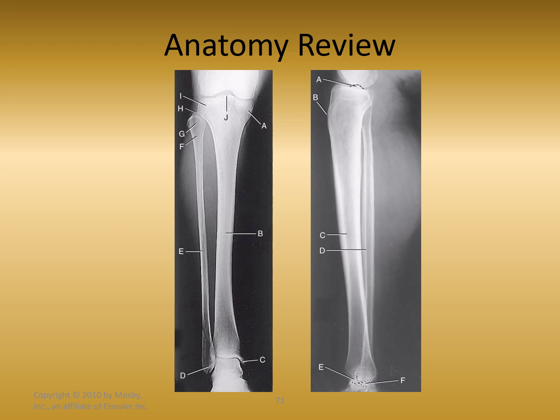Okay, so I want to focus on the lateral position. This is the lateral position here, since we just looked at the lateral position of the tib fib. On a true lateral with no rotation, we will see B is the tibial tuberosity in profile. Criteria: proximal tibiofibular joint superimposed.